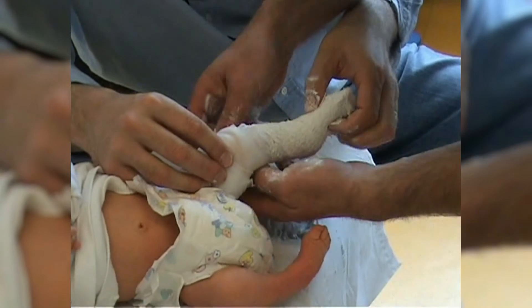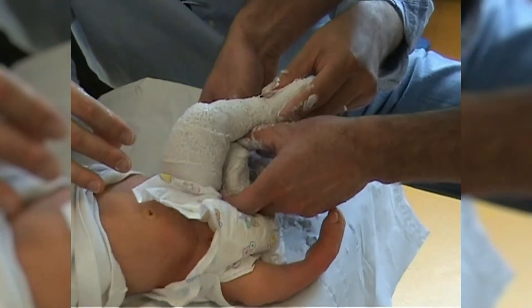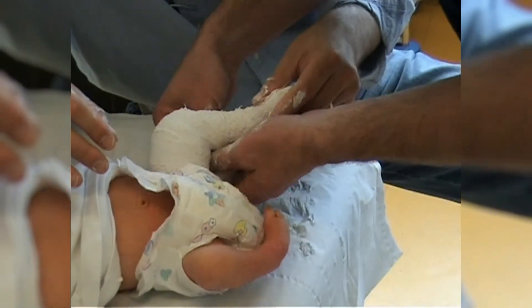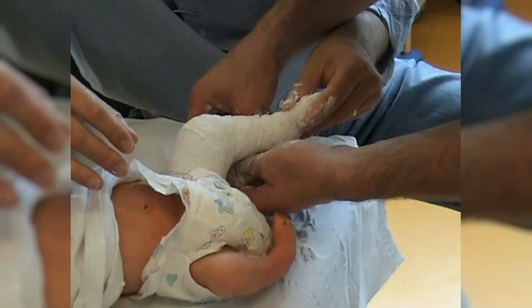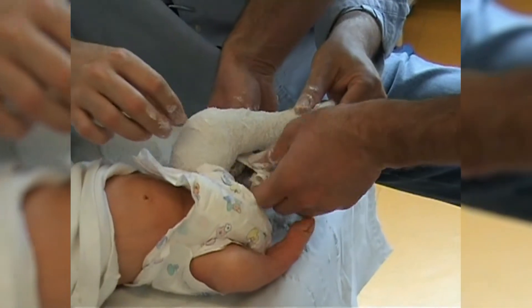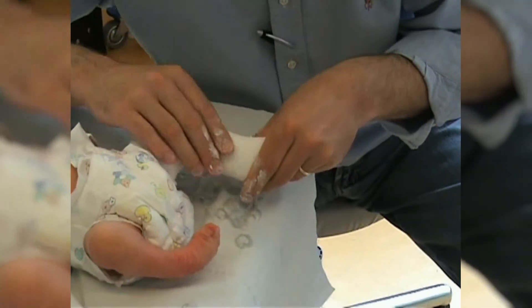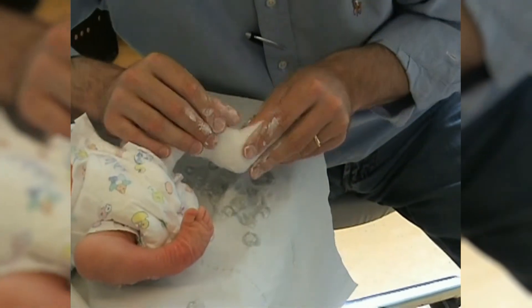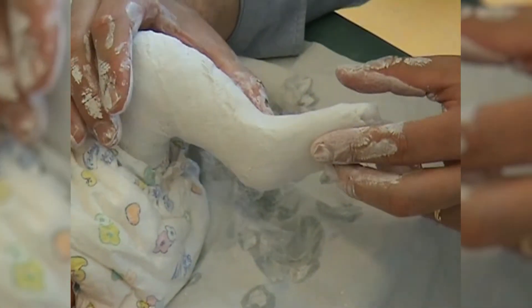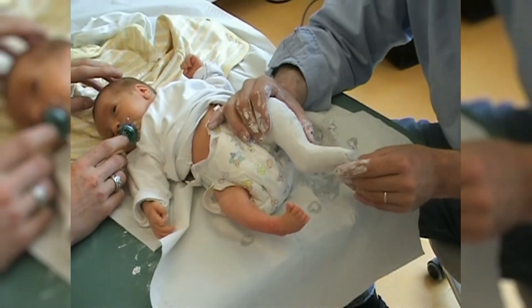It is recommendable to use quick-setting plaster. In the case of a calm child, the cast can be applied immediately extending to the groin. If the child is relatively active, it is recommended to apply the cast in two steps. A long leg cast should always be used because otherwise the cast will not keep the increasingly abducted foot in place. Here you can see supination of the foot by lifting the first ray, the lateral fixation of the talus, and avoidance of direct manipulation of the calcaneus.